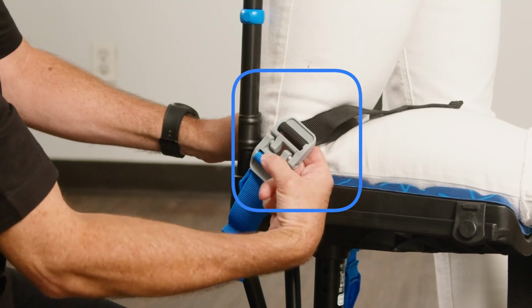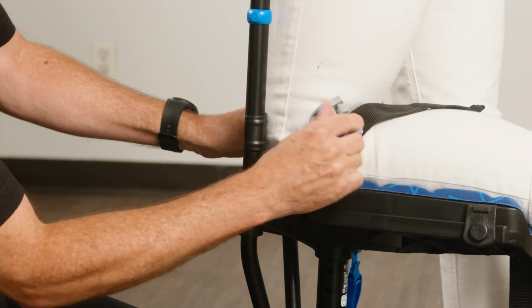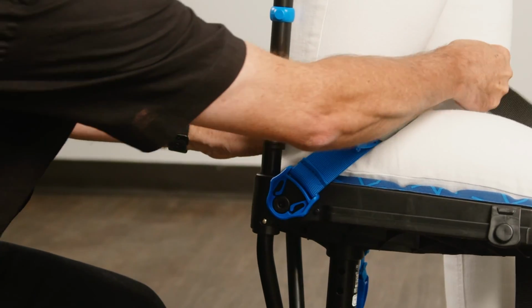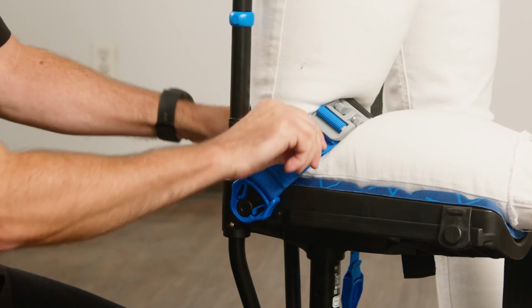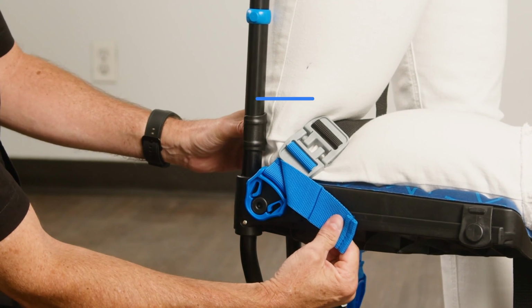If the buckles are almost touching, but the strap is still loose, loosen the blue section. Then slightly shorten the black section. Retighten the blue section and check your adjustment. Repeat the process until the strap length and tension are correct.